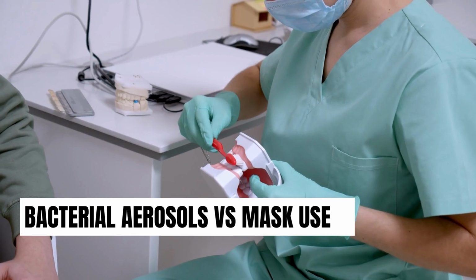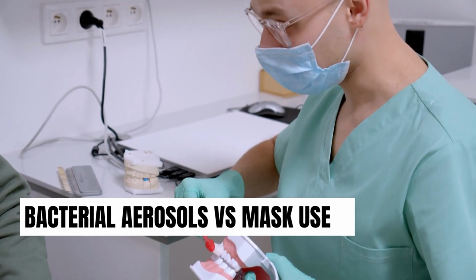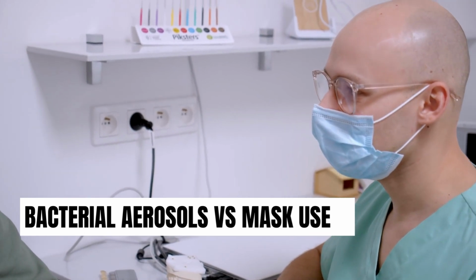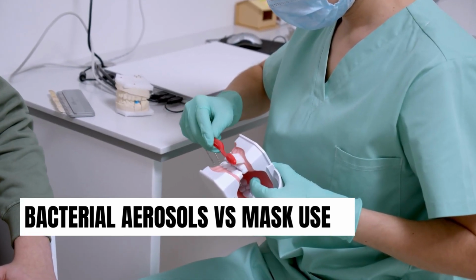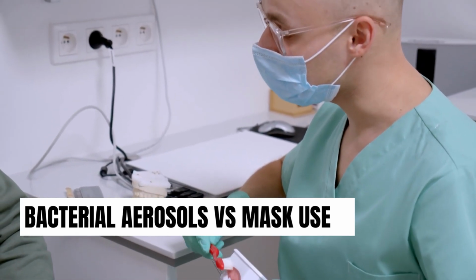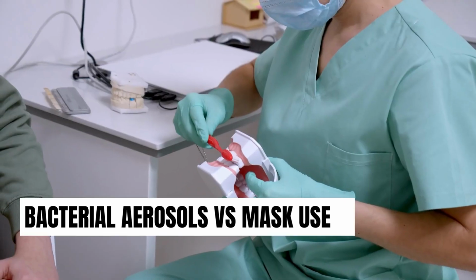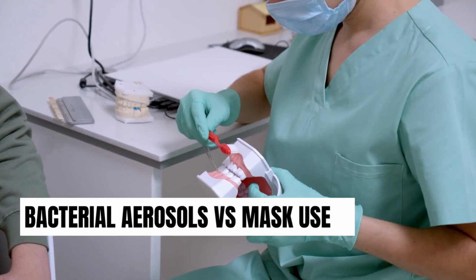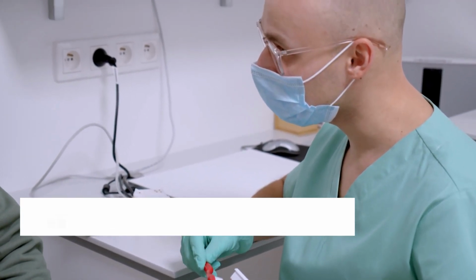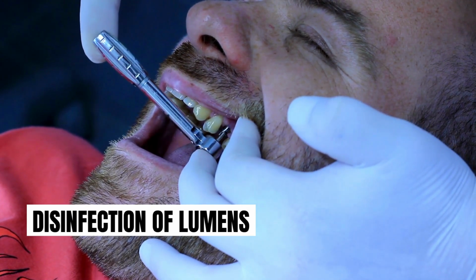Aerosols are defined as small droplets, usually 5 micron or less in diameter, which can remain suspended in air for some time. So, bacterial aerosols are an important consideration for infection control and occupational health in dental clinics, since infective agents can be transmitted via aerosol to the patient or dental staff. So, masks and other personal protection measures must be taken while offering any treatment to any patient in any dental setup. Check the dental handpieces before any procedure is attempted on the patient.